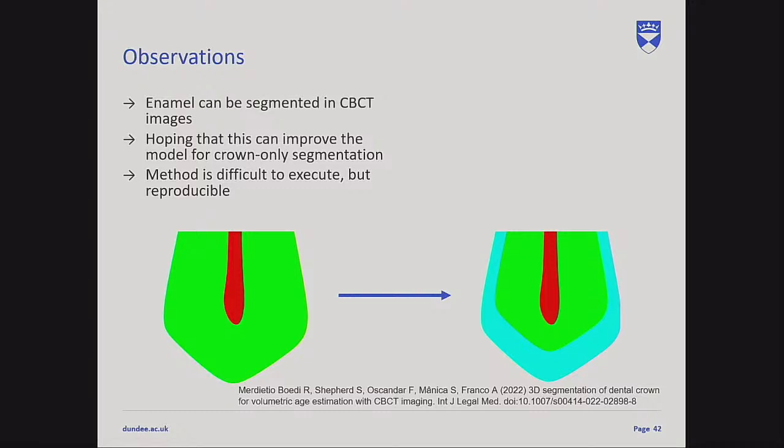I've done the reproducibility test with a colleague. She is a radiologist, an oral radiologist, and it's still really hard. Like we have the reproducibility number like 0.7, it should be like 0.9. Jadi agak susah, biarpun sama teman saya yang FKG, ini pun agak sulit. But bear with me, it's okay.